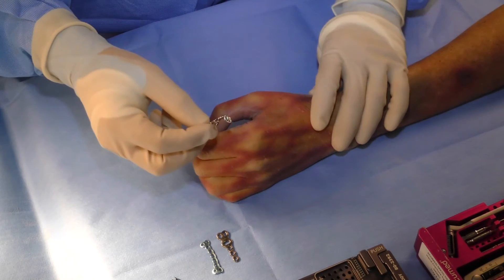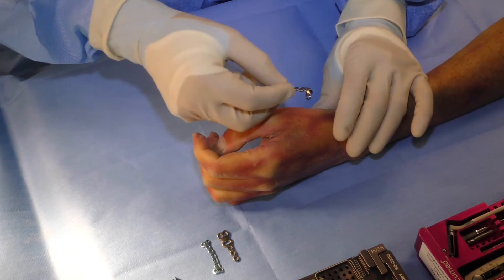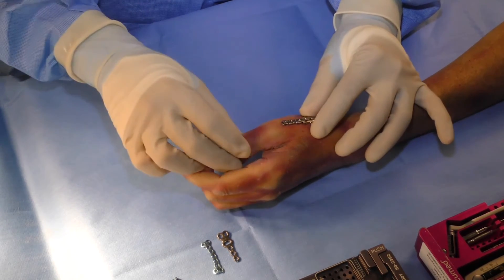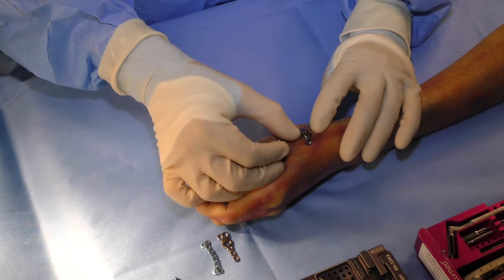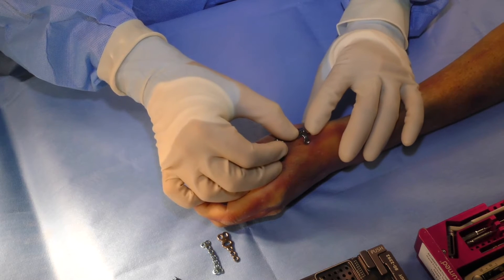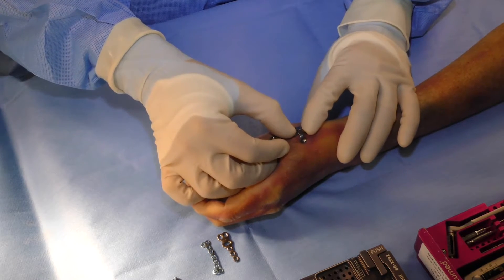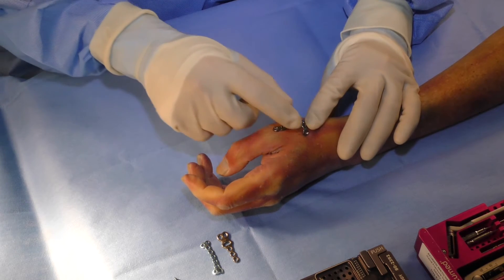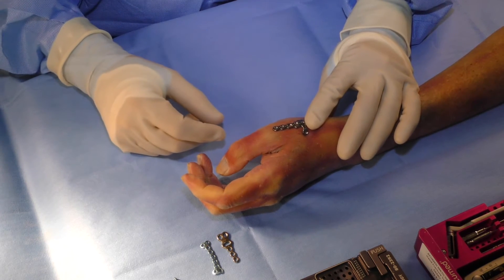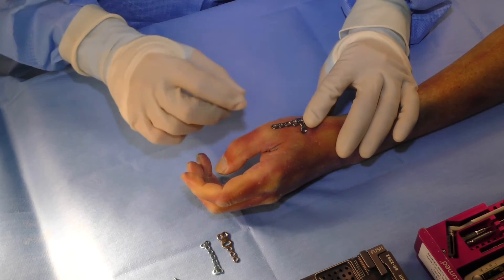The Rolando fracture plate is designed to sit at the base of the thumb metacarpal, and this is typically how it would be positioned. The hooks will engage the abductor pollicis longus tendon and the key fragment there, providing some immediate stability while the rest of the fracture fragments are aligned alongside the plate and fixated.